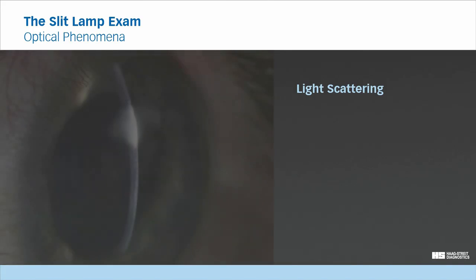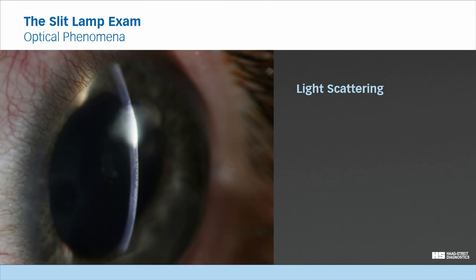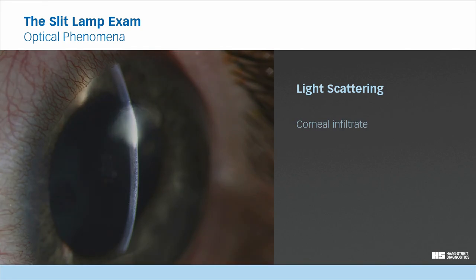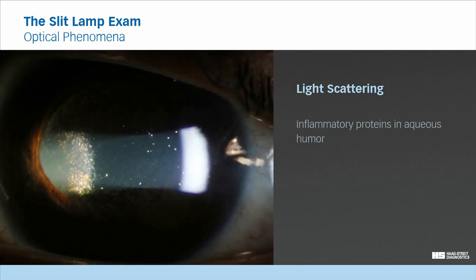During the slit lamp examination, this phenomenon is frequently observed. For example, in this case of corneal infiltrate, the light is scattered and provides information about the dimension of the lesion. Or in this case of ocular inflammation, the light is scattered by the inflammatory proteins in the aqueous humor.